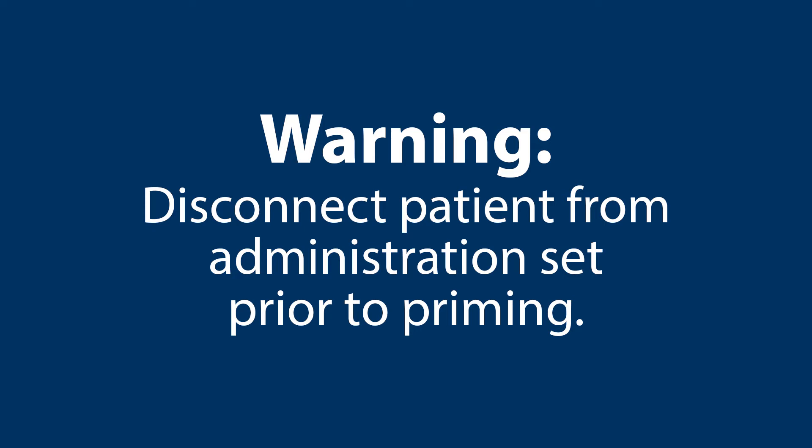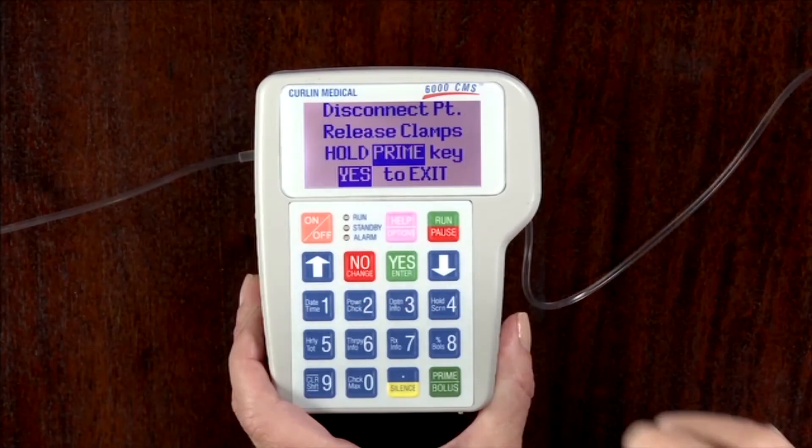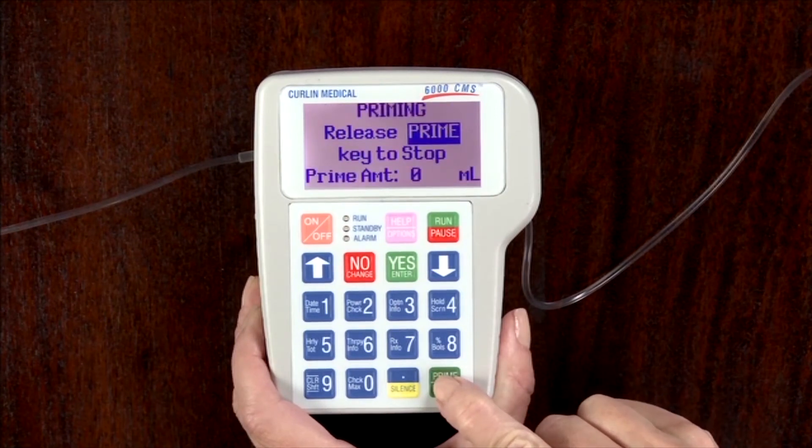The administration set must be disconnected from the patient prior to priming. Press the prime key again and hold the button down until the administration set has successfully and completely primed.